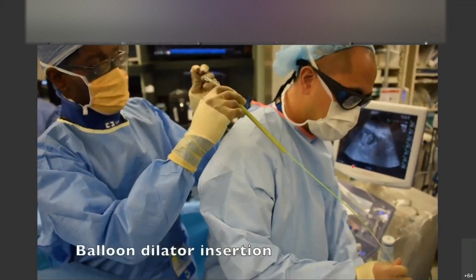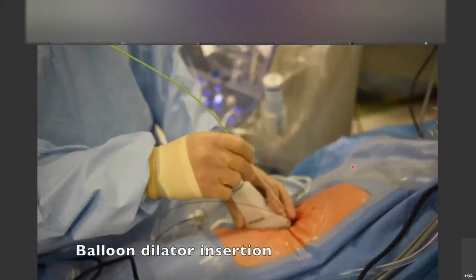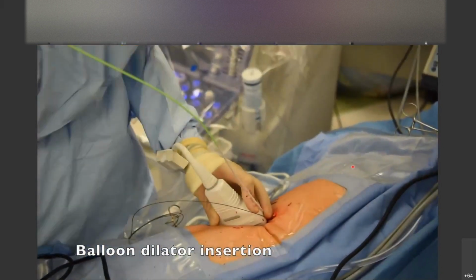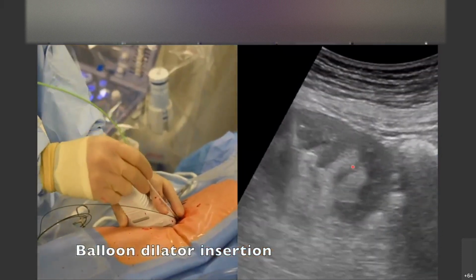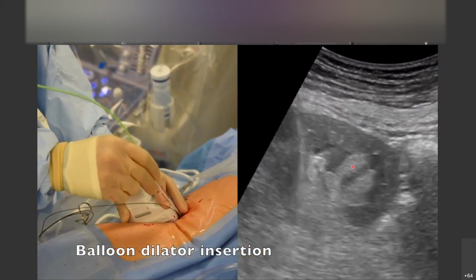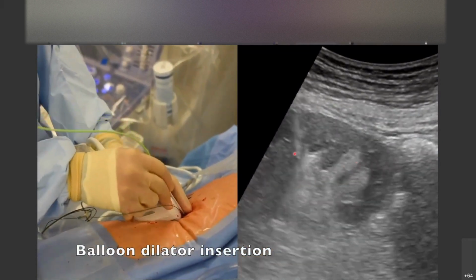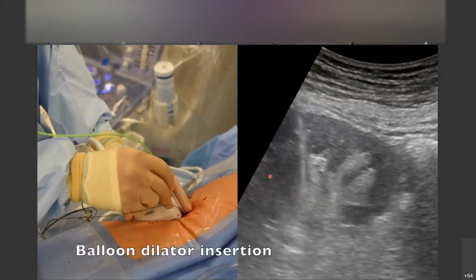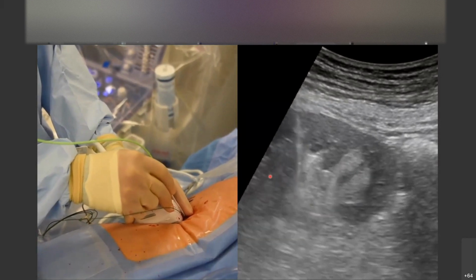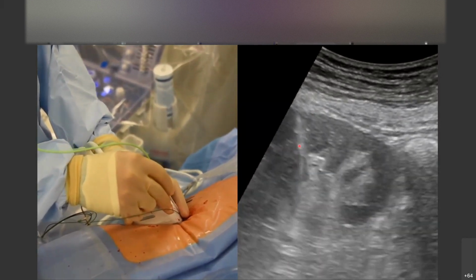The nicest balloon I find is this Bard Nephromax balloon. It has a 30 atmosphere breaking pressure. It's also nicely visible on the ultrasound. So here you're going to look for that wire to disappear as the balloon is advanced, tip of the balloon is here. That nice white line is gone. Sometimes you can see this, sometimes you can't.